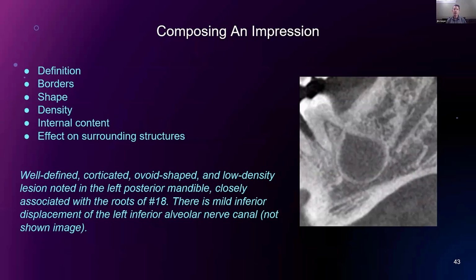I think now we're going to look at, we've gone through all these different shapes, borders, and defining things, but what is the impression of exactly what we're seeing? So you're going to take us into that. Absolutely. So now Dr. Biccolini and I want to take all this information that we presented and put it together to form an impression.